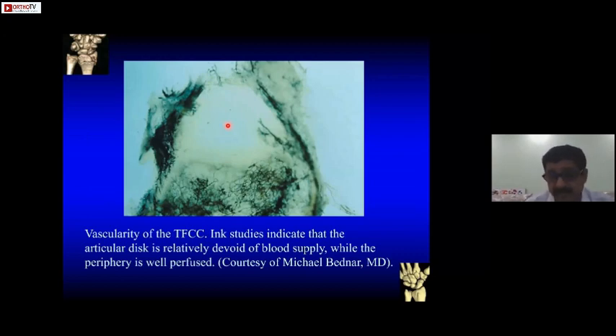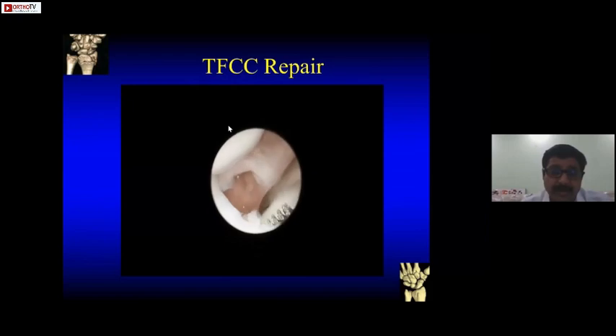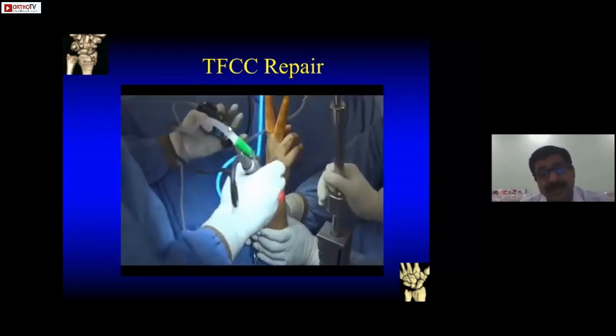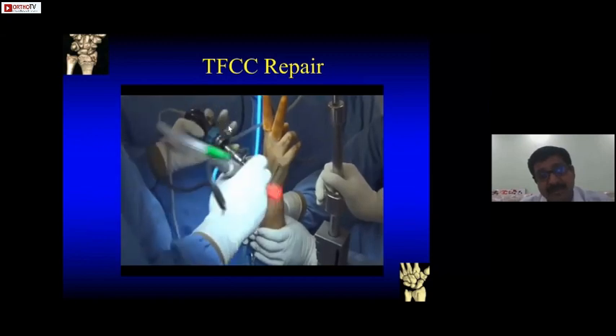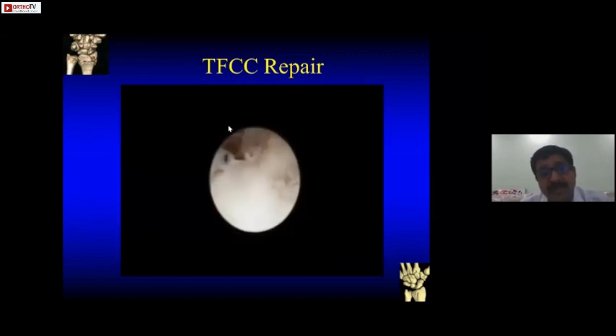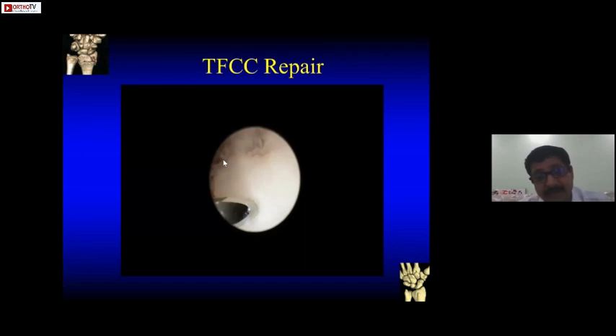We'll see an example of a peripheral tear. Arthroscopically, going through the 3-4 portal, you see the tear, assess it, and always debride. There's some amount of synovitis — debride the edges. Once you have debrided the edges, reassess your tear. This is a U-shaped tear plus a longitudinal tear in the TFCC — it's a complex tear.